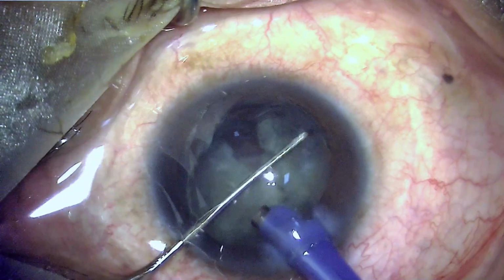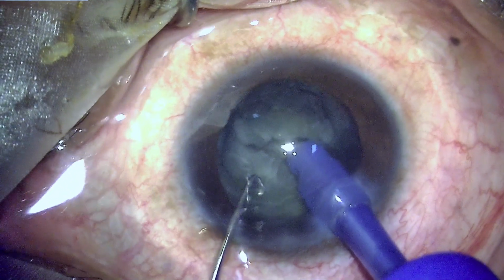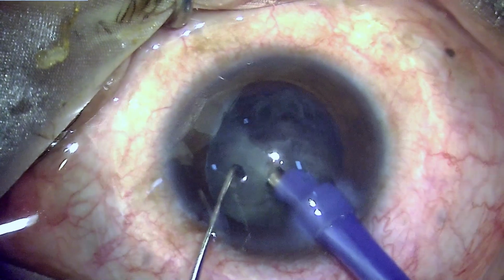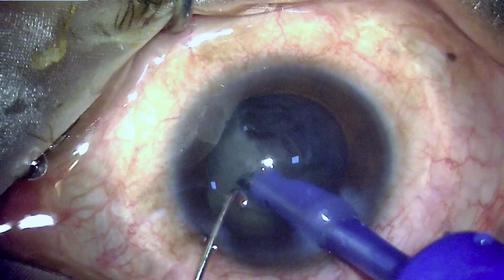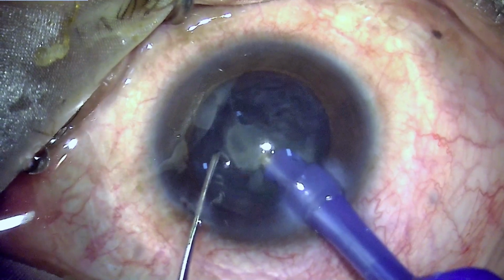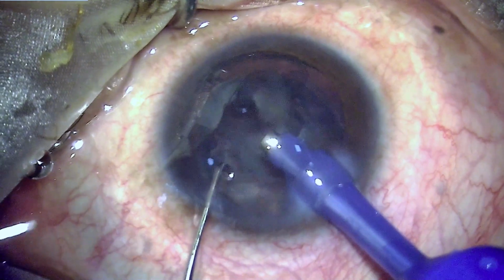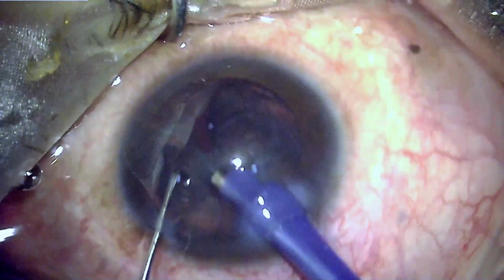It is always a good idea to segment the large pieces into smaller chunks, and this will prevent any injury or insult to the endothelium, because then it is possible to perform the emulsification process in the capsular bag, because smaller pieces will not prolapse out into the anterior chamber. So this is one key factor which I have emphasized in one of my videos, where I have used this technique and explained how one can have a pristine clear cornea if one is operating on hard cataracts.